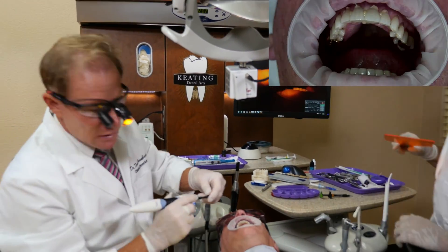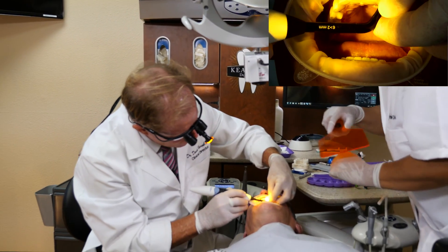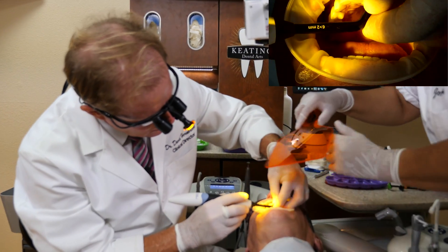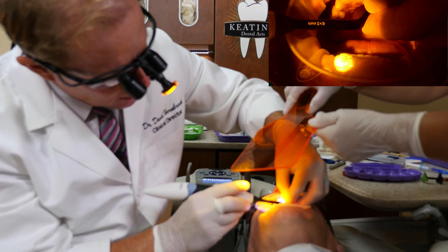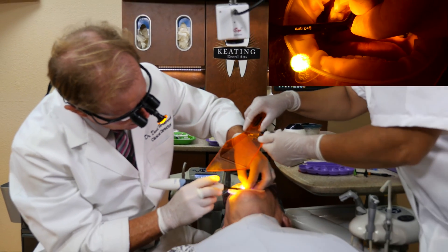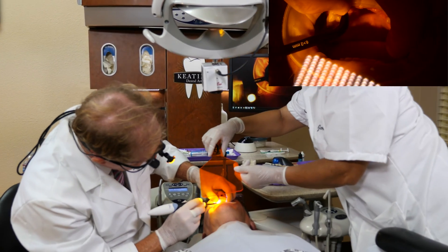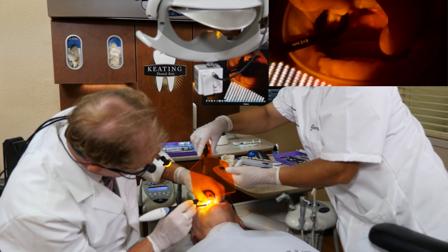Now we're going to do it from the lingual as well, since these are full coverage crowns. If these were veneers, it would just be on the facial. We tack each tooth with one-second bursts from the lingual.